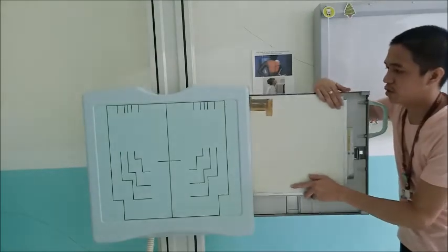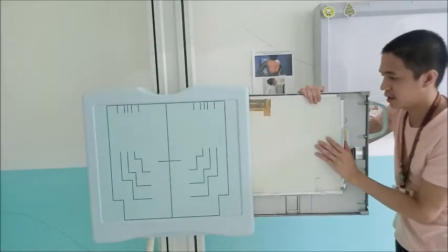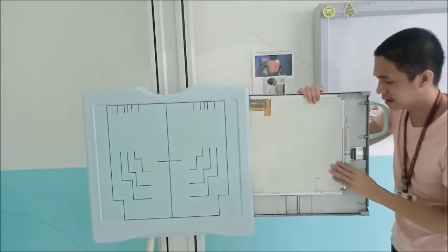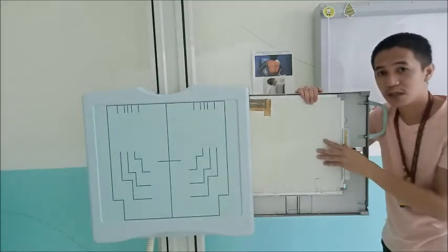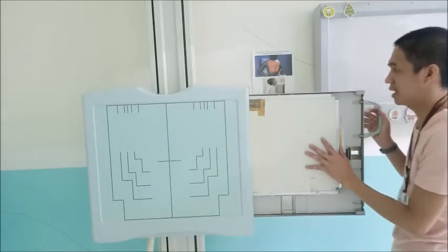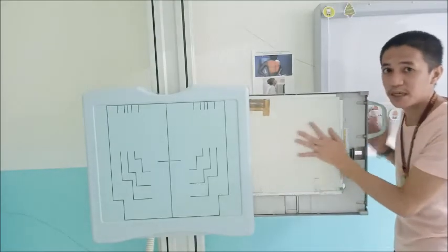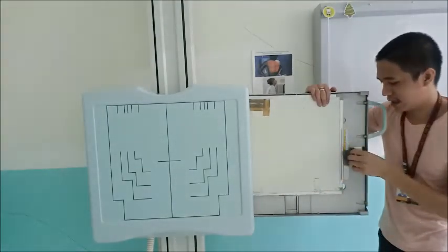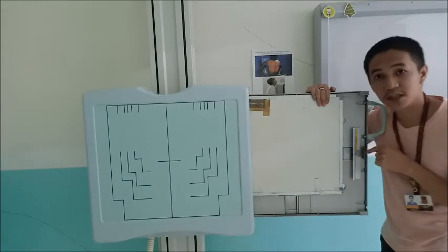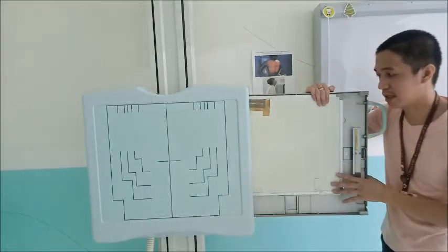So you have to make sure that your cassette is locked in place. For example, if it is loose, it will not be maintained. Sometimes the intern forgets to lock it.